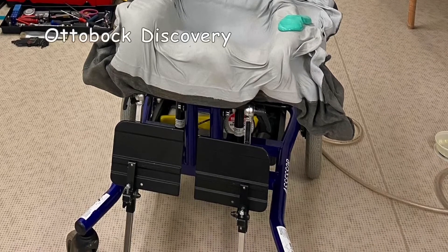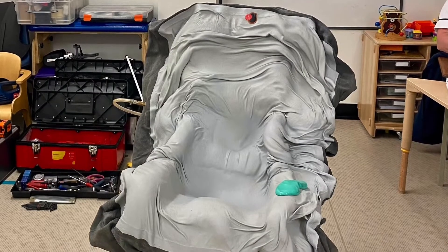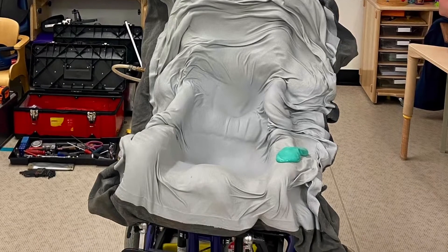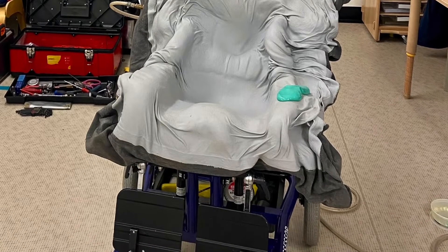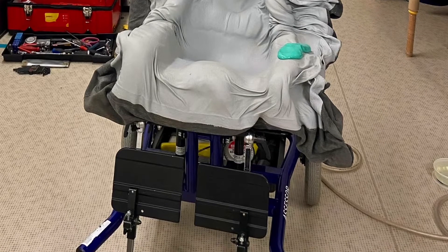I am getting another Ottobock. I do not know the base of the wheelchair — this is not the wheelchair that I'm getting, it's just one that they're using to make the mould, like the seating for me and whoever else is needing a new motor seat. So what you're focusing on is the actual motor seat, and that's the grey part.